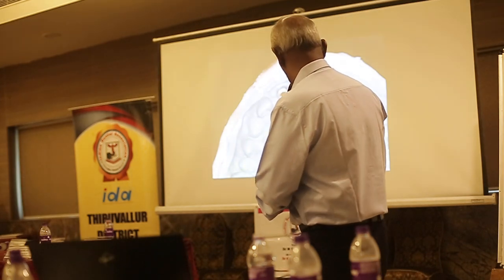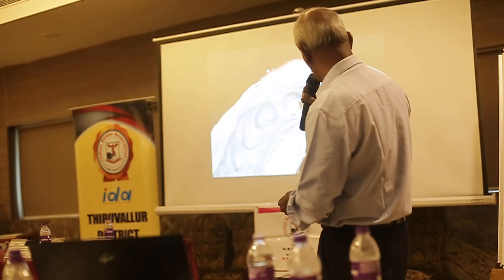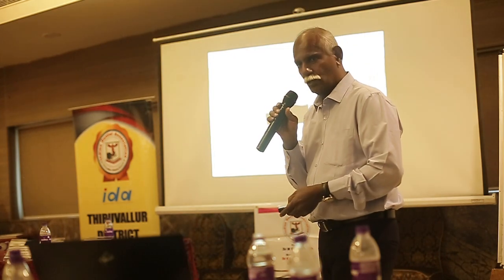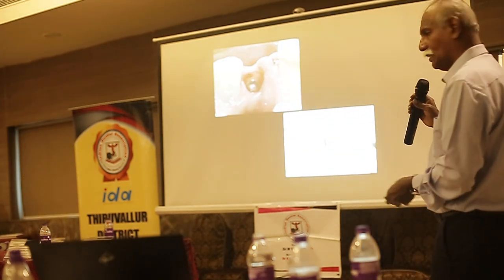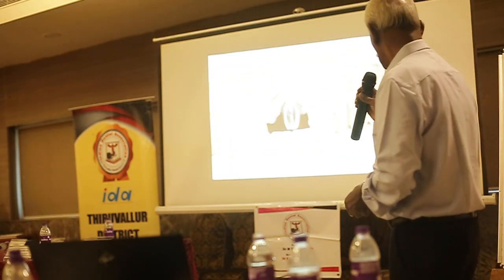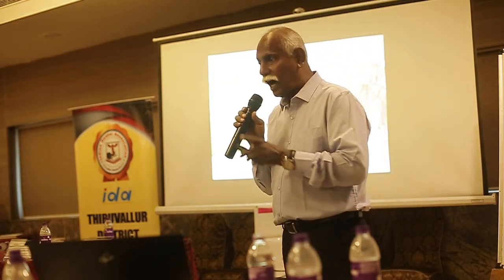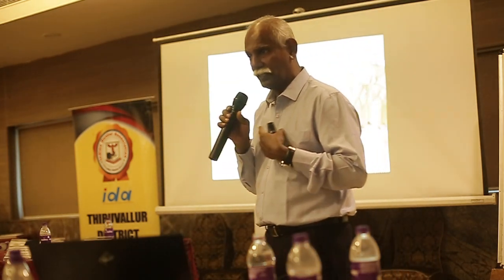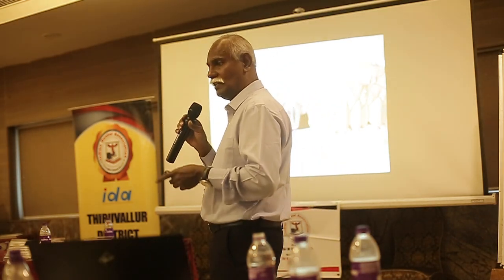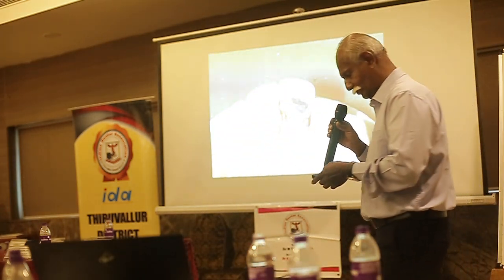So this is how it is. We made the impression. The lab analog is connected and it's sent to the lab. Can you see the actual reproduction in the cast? The laboratory milled it and sent it back to me for approval. I am the deciding man, not he, to check the clearance and everything. The same thing was seen in the patient's mouth. He made a beautiful ceramic.